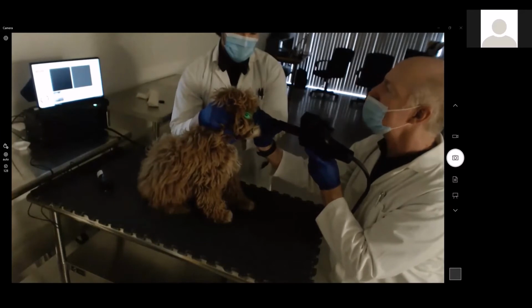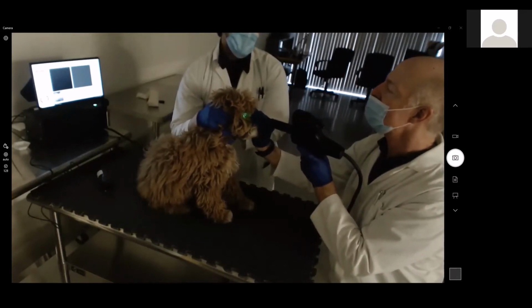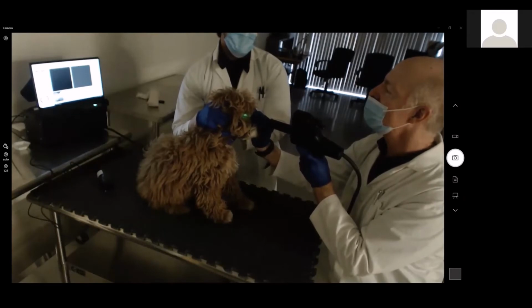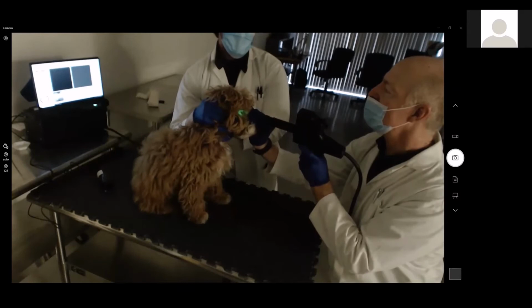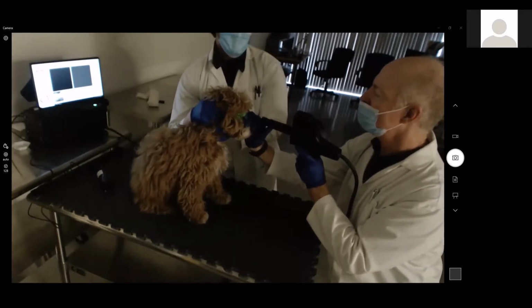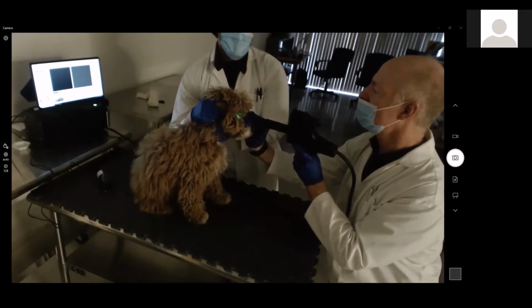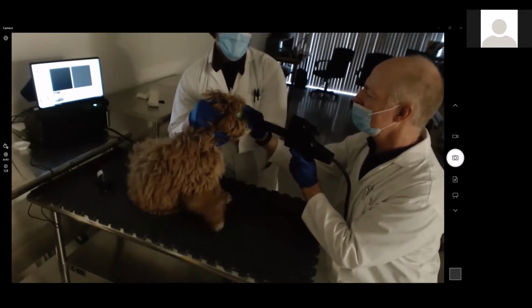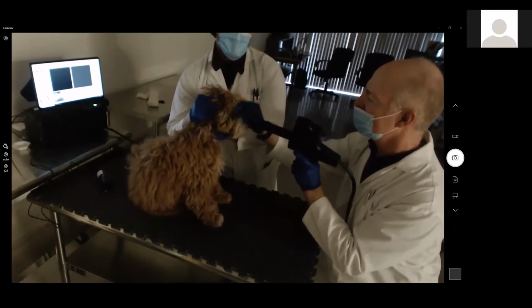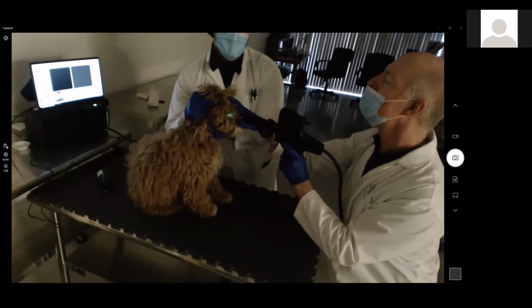Okay. Is the system on? Yeah, good boy. You're doing really well. Can you taste the kibbles on my finger still? You've got a little hair in your eyes here. Okay, good job.